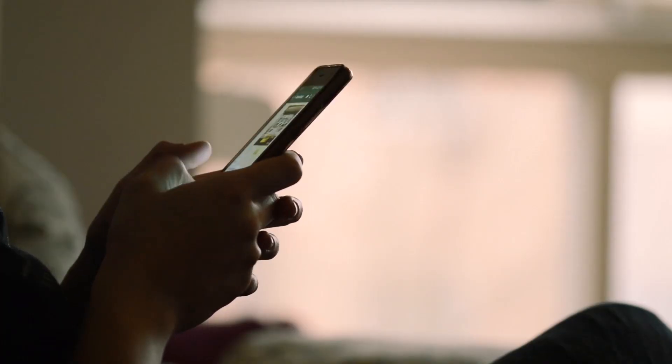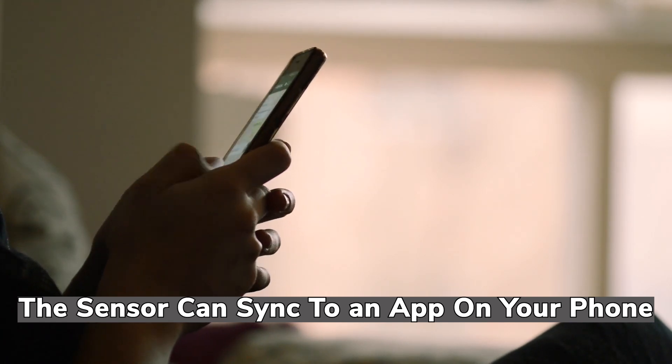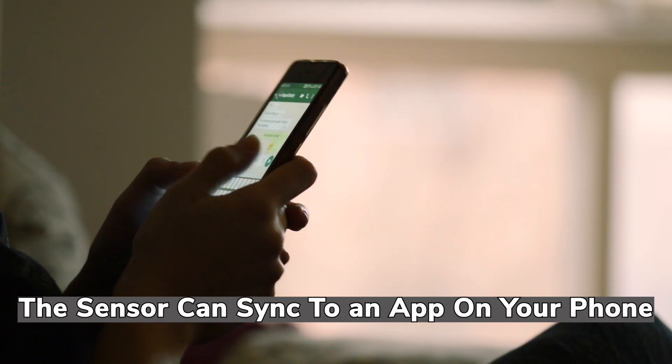You wave it here, it picks it up, and it gives you a reading on here. There's also an app that I'm going to put on my phone that will give me a reading going back several hours, so I'll be able to see what's going on during the night.